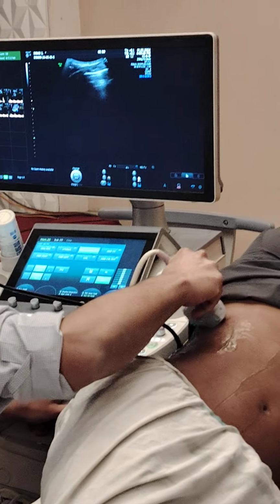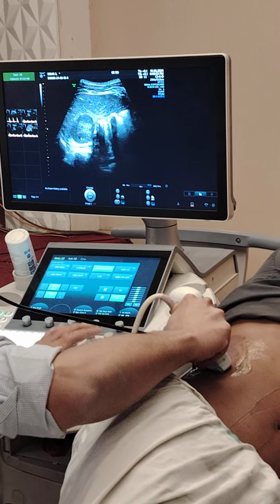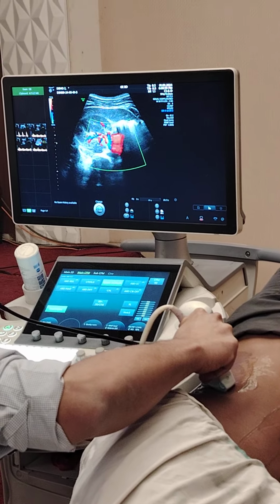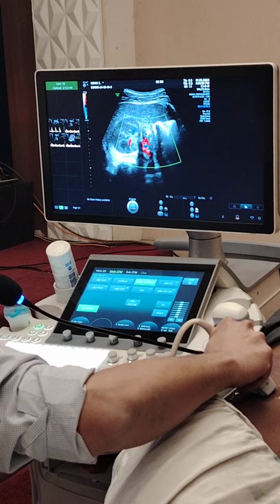Right, so after that is done, now I try to move on to my renal artery. One of the best ways to identify the renal artery is to try and go transhepatic or subhepatic. The problem over here is you have the IVC and the renal vein, so your artery goes behind that, the right renal artery. So it's a little difficult to identify the origin.